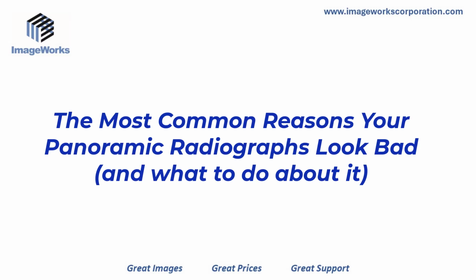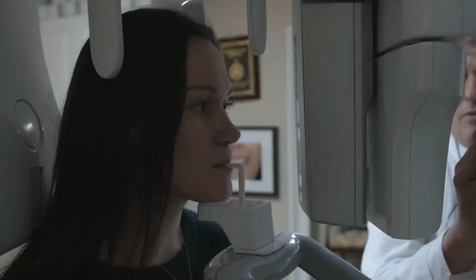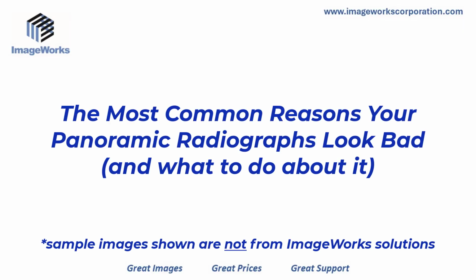Some studies have shown that only about 10% of panoramic images captured are free of errors. With these challenges in mind, ImageWorks wanted to create a practical guide to serve as a roadmap to help any panoramic X-ray user maximize the value of their piece of equipment.